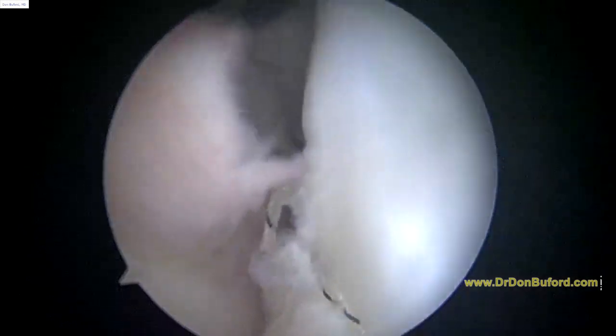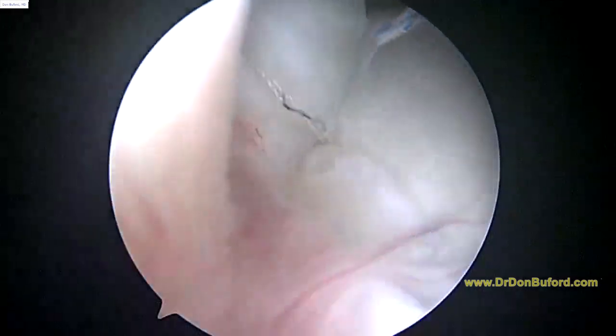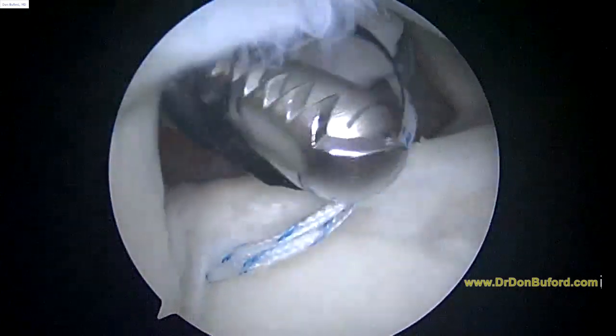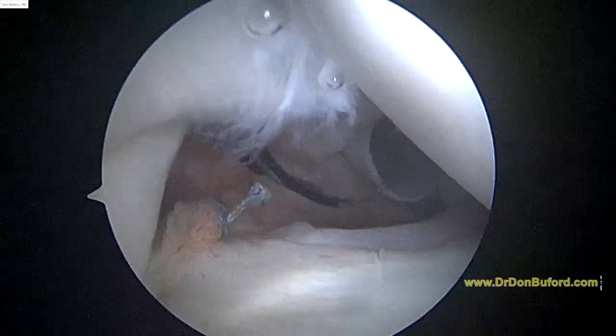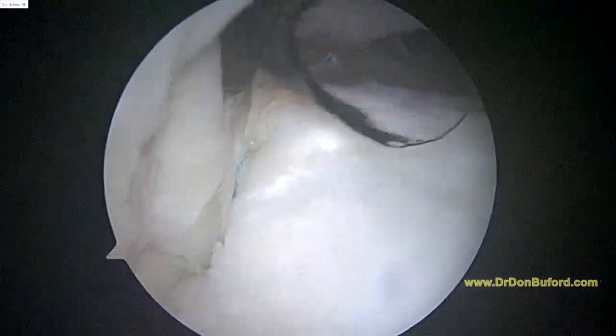Here's the first stitch. You can see it behind the biceps there. Snug. That looks good. And now we're going to do the same thing on the other side of the biceps tendon over here. We'll show you that in just a minute. Okay, so now we've got the anterior suture tied, and I'm happy with the way that looks. Rotator cuff's fine.